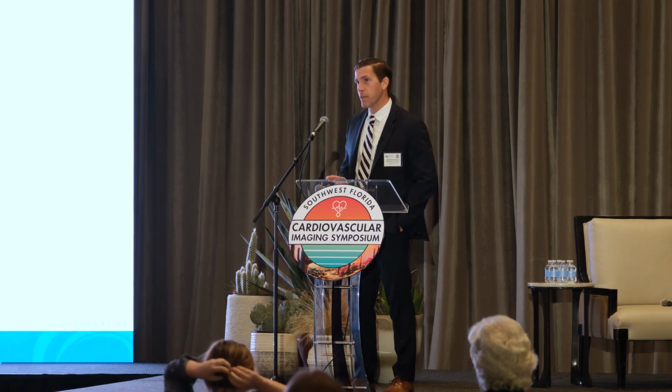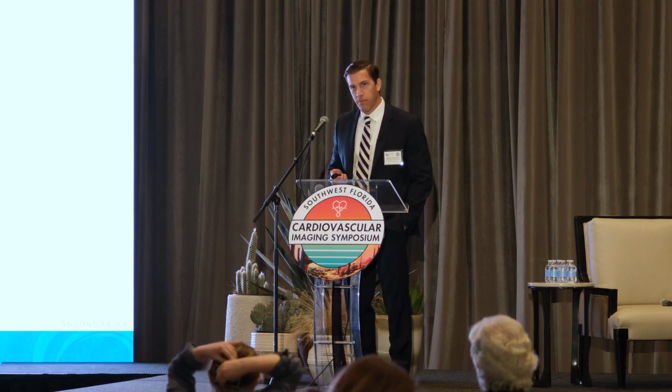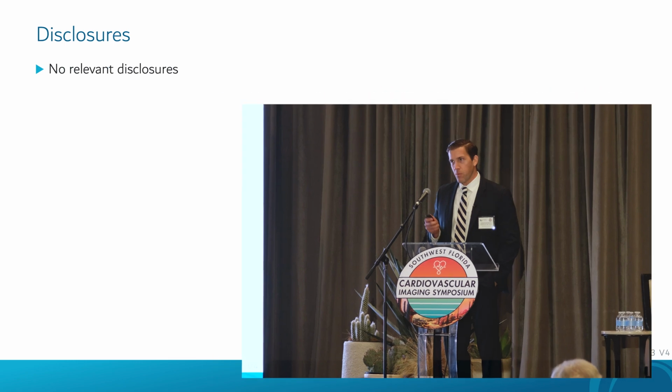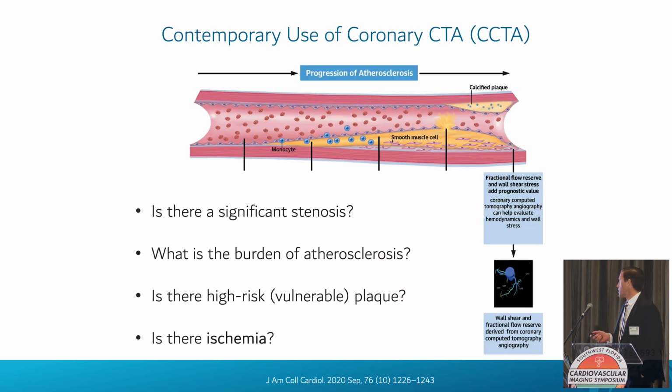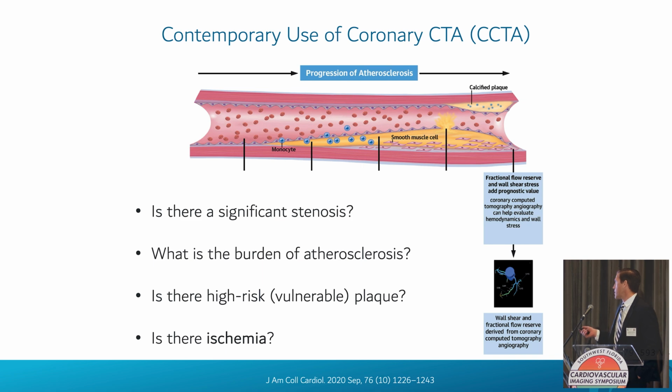My topic's on CT-based FFR. We've talked a lot this morning about the benefits of coronary CTA. I think one element of coronary CTA that really sets it apart from other imaging modalities is the fact that it can evaluate coronary atherosclerosis throughout really the entire continuum of disease, including at a very early subclinical level, and that's been great. We've leveraged the benefit of coronary CTA for its negative predictive value, so safely excluding coronary disease in patients low to intermediate risk.